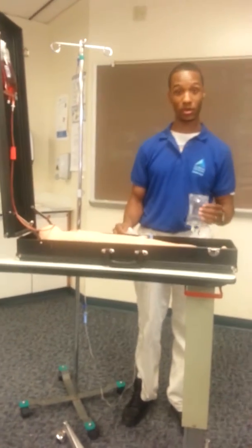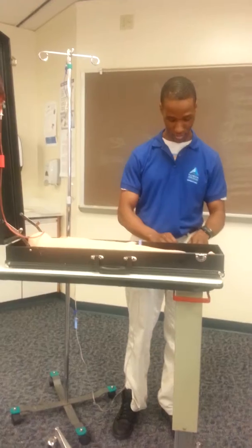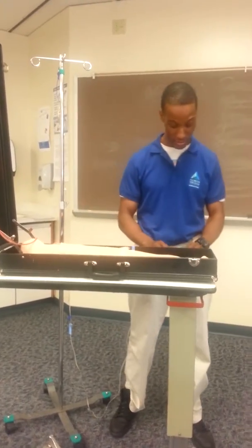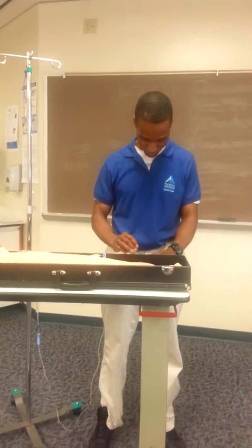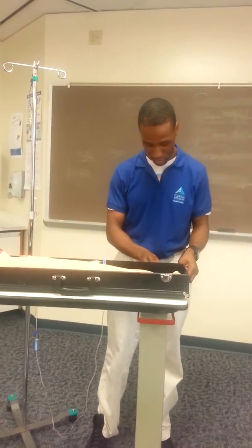Now I'm going to label my medicine. I'm going to put on there my initials, date, time, the patient's name, room number, the drug and the amount, and the flow rate. And I will also put on the start time.